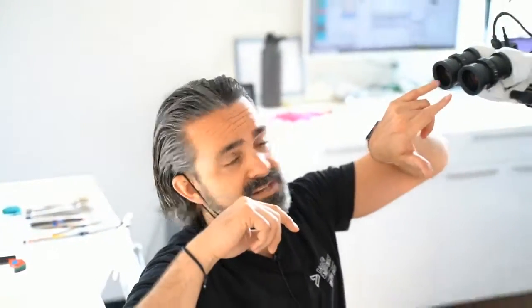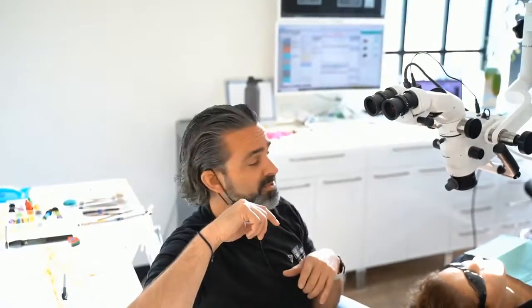And heat, if you run hot, Florina, then when you use a lens cap, your body temperature can actually fog it, just like I live in Utah, so I'm a skier, and it's just like my lens goggles. So I use an anti-static, anti-fog because then these don't fog on me.